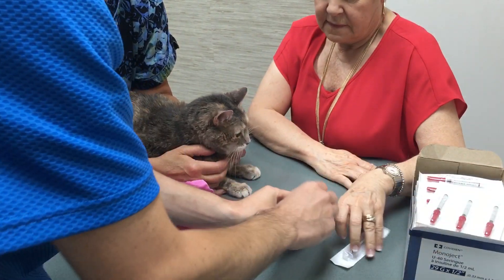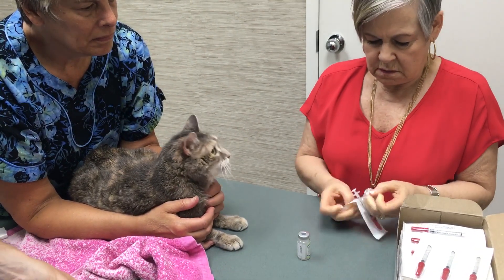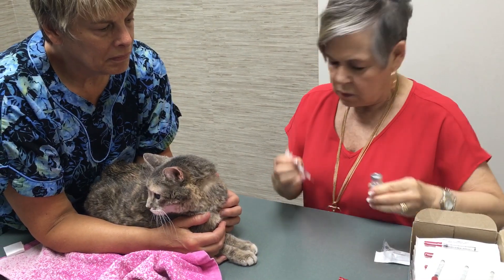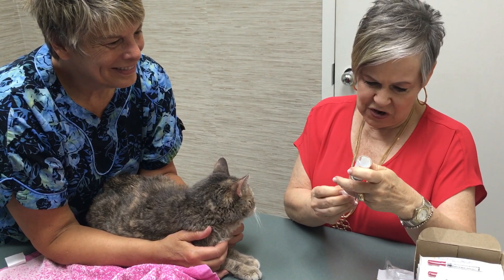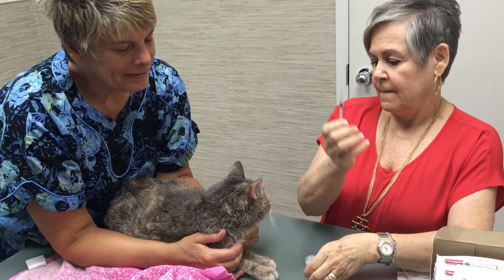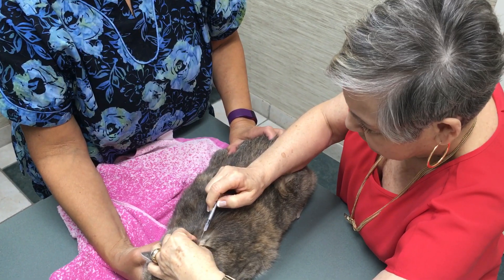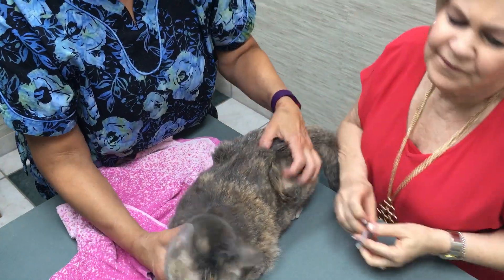And again, you don't care if you clean that off first or anything. If you want to bring home some alcohol wipes that makes you feel better, you're more than welcome to. So there's one unit. All right, sister — get it all in. Kind of hard to keep that little fold right there. One, two, three. That's not my best aim, but pretty good.